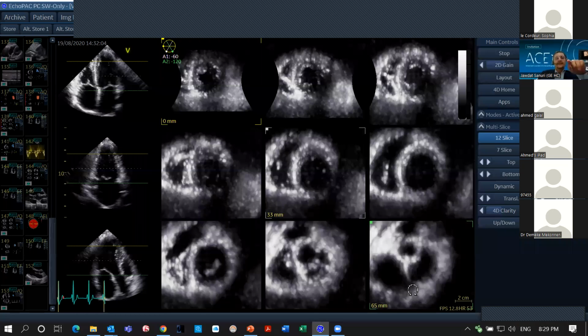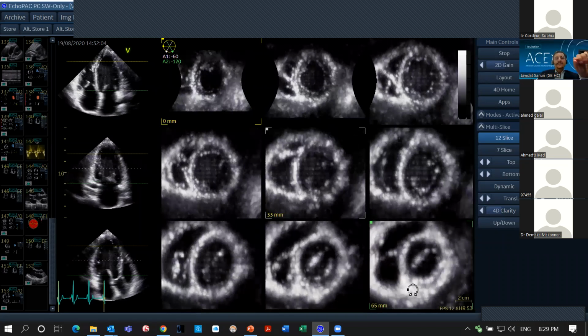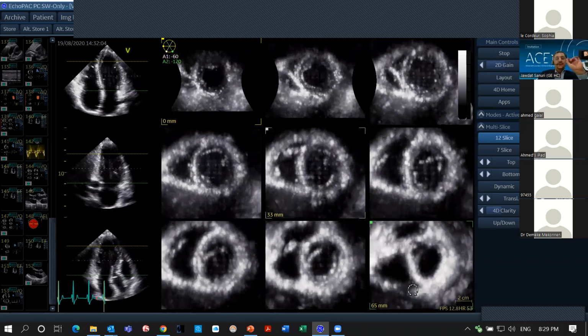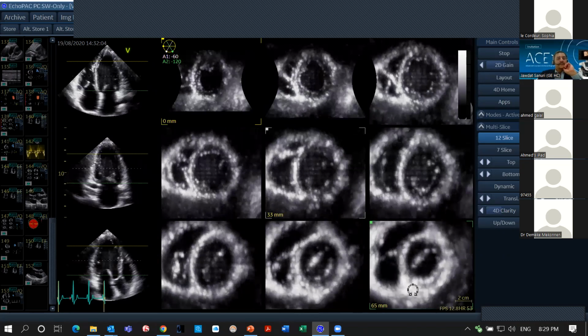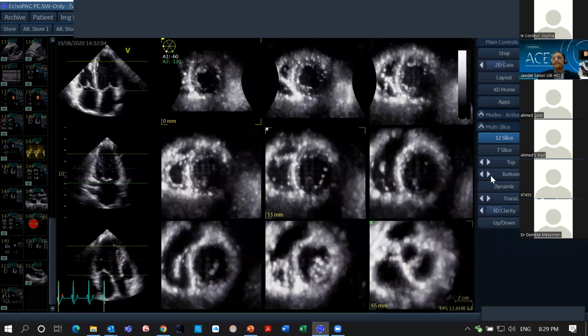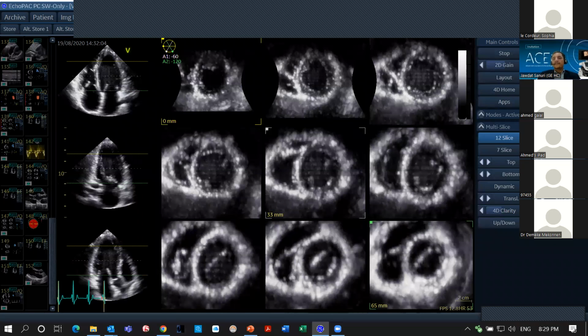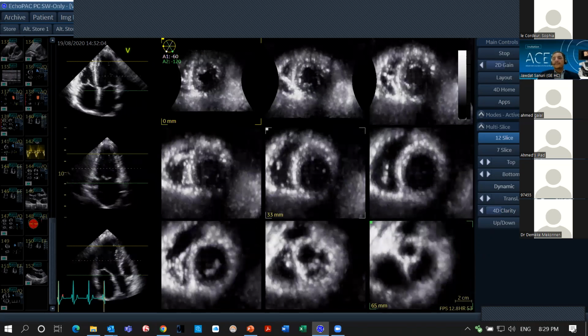So you're using the flexi slice or multi-slice? Flex slice, for here. And this in the LVQ, I will take the large volume which is used for LVQ. So if I use the flexi slice option to assess the mitral ring, then the area assessment will be very accurate, very nice.